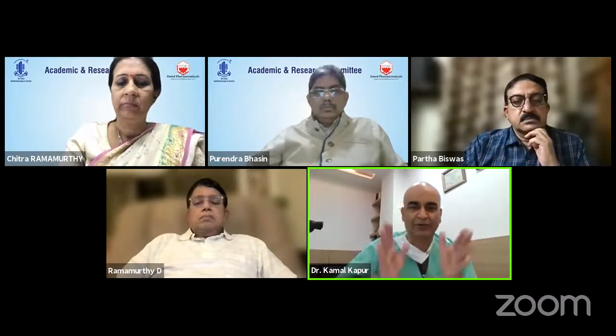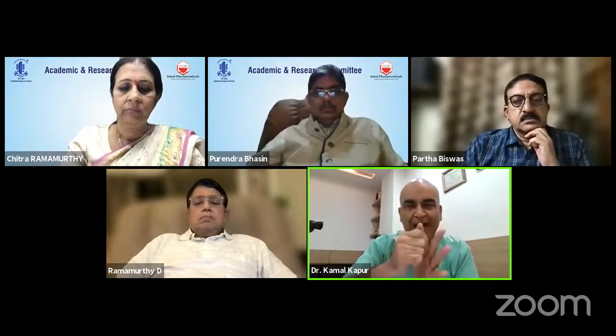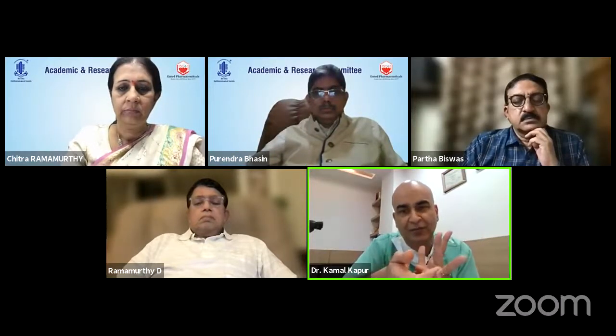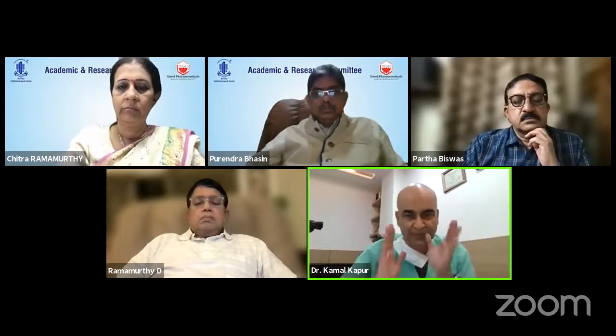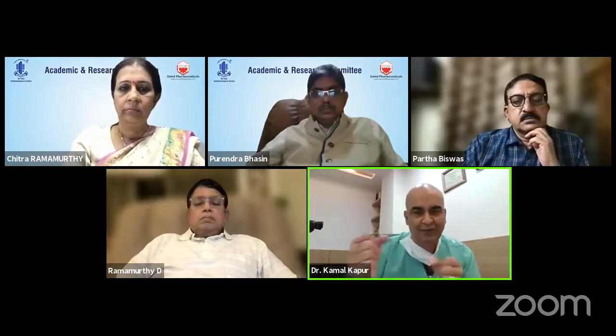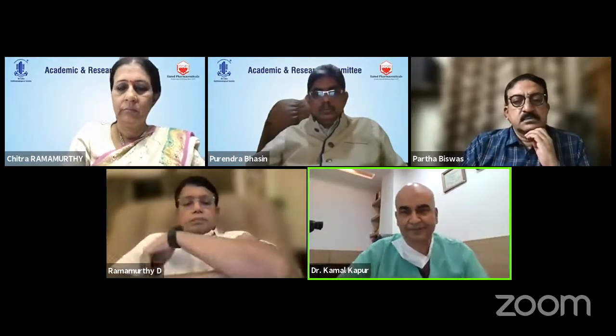So I think 2.8 for a normal standard case with your standard keratometries, good angles, good lens rise, not high lens rise, more than 600 microns. These would be few borderline cases where I would stick to the dictum of 2.8. Otherwise, I would like to use more levers to find where I stand properly.